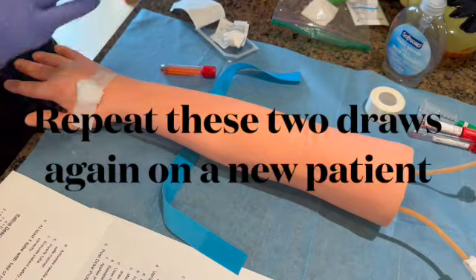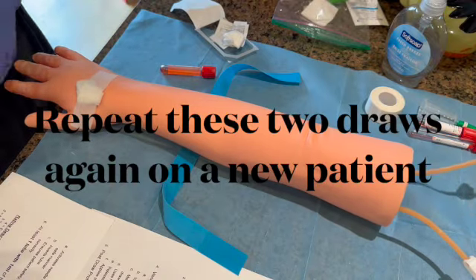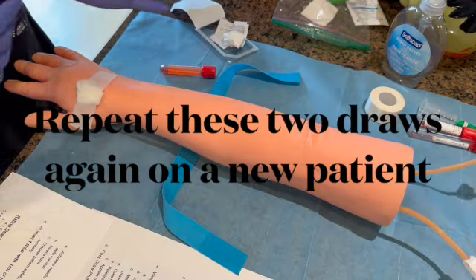Okay, and then last but not least, this is just going to be done 2 more times. So once again with the straight needle and once again with the butterfly in the hand in another participant or volunteer or student or patient.